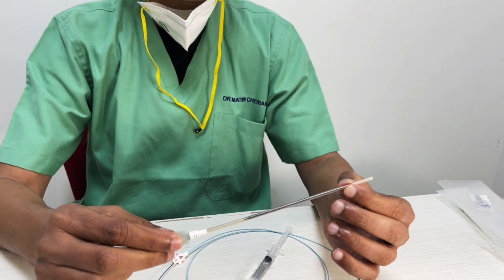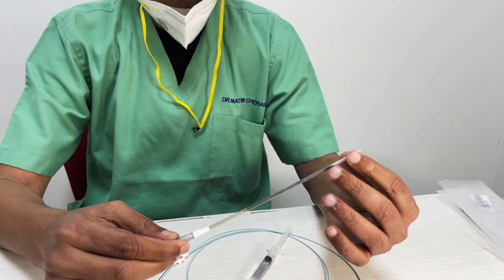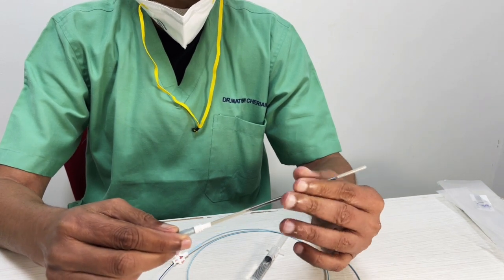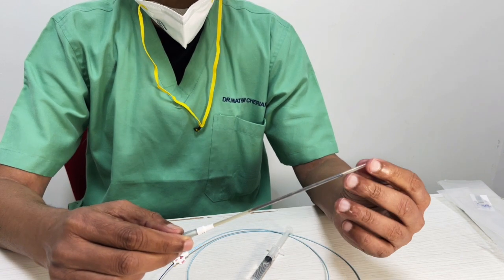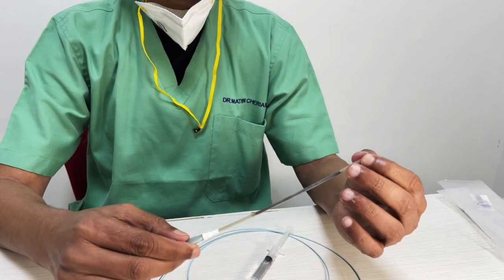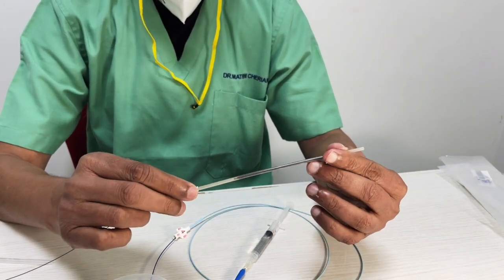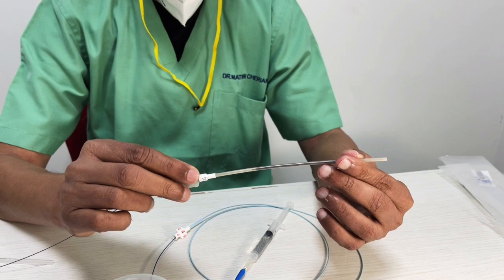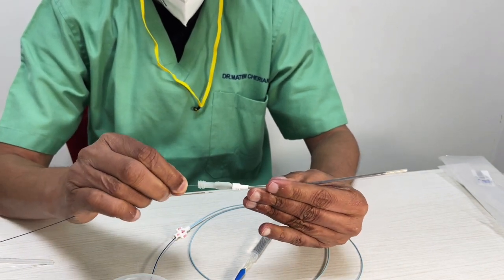inside the sheath. So this is what I said, that if the valve is very tight, like you see with the Cook's Ansel sheath, you may find it difficult to push. So if you have a guiding cath, it's much easier because this goes through the Y connector. Once it goes through the Y connector, you push it into the hub and keep it tight at the hub so there is no space, and then you push this device.